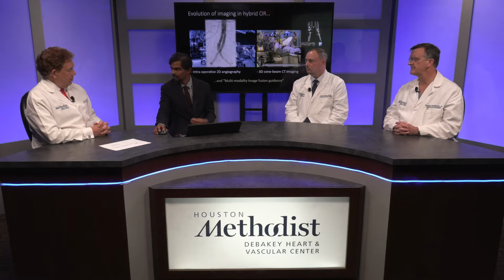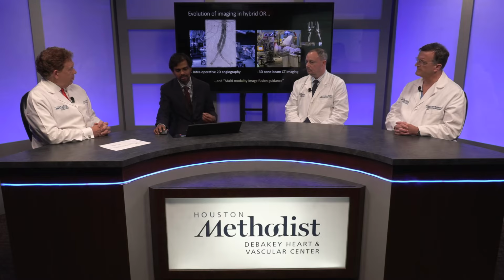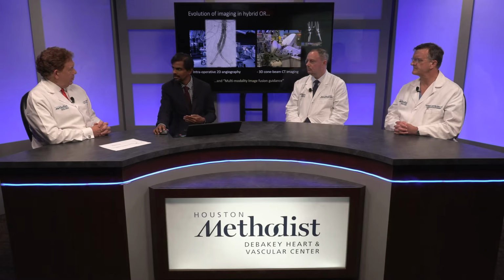So what I'm going to talk about here is how we can really enhance fluoroscopy, which has been there for years and decades. One of the common limitations is that it is planar imaging. We don't have depth, so we are trying to see how we can bring the third dimension and possibly the fourth dimension to these 2D images.